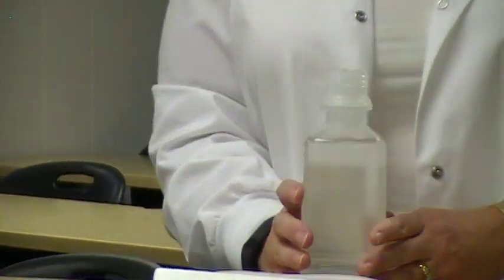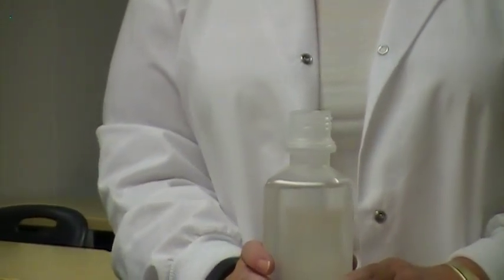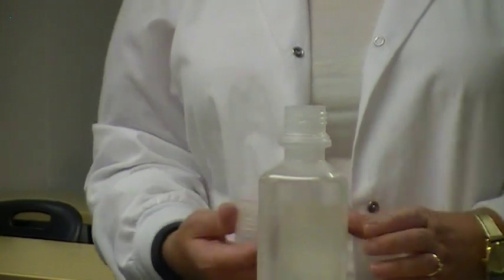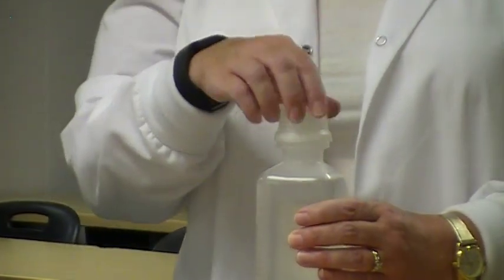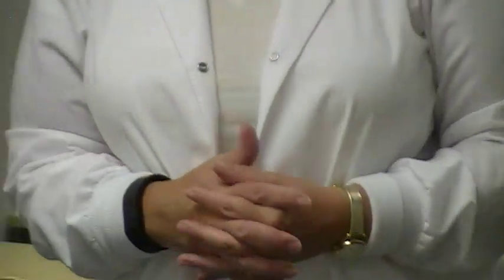Once I get done, I want to make sure that I put the cap on the bottle as soon as possible. The longer that a sterile solution is exposed to air, the more it can be contaminated. So after I get all my solutions poured, I'm going to put the cap back on, snug, and then I'm ready for my physician to come into the room. Also want to make sure, since I removed my gloves, go ahead and wash my hands and get prepared to assist the physician in any other way.